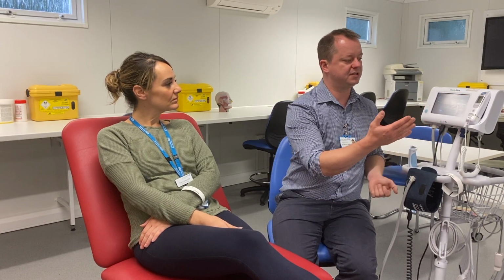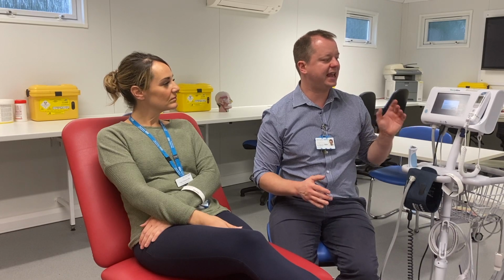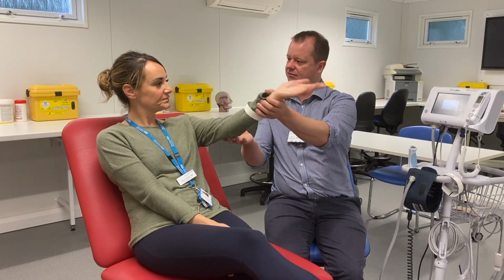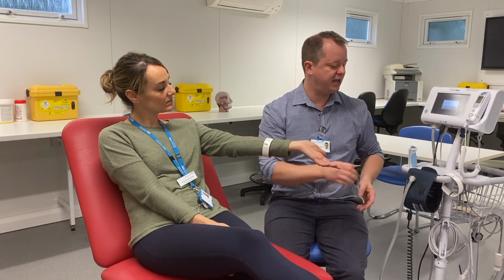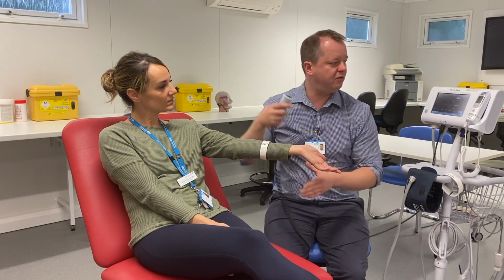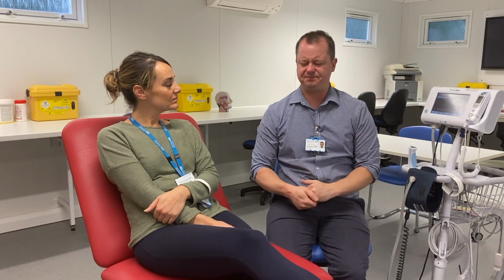We want to record someone's vital signs, so we're going to click on that part, and then it's going to ask us to scan the patient's ID. Each patient will, like Tina is demonstrating, have a wristband on which has a barcode on it. It also has a QR code, but a barcode is what we want. We use this scanner on the side to capture that barcode, and then it will record that patient on here so we'll know that we've got the right patient.